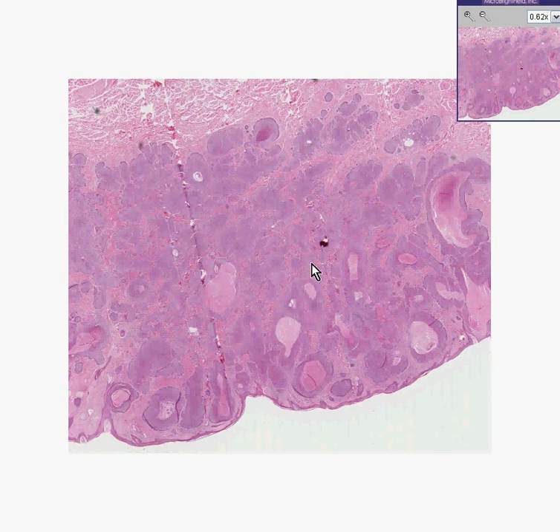The instant algorithm that should appear in your brain when you see primary skin tumors of epithelial-looking origin is: are they squamous, are they basal, or are they melanoma?